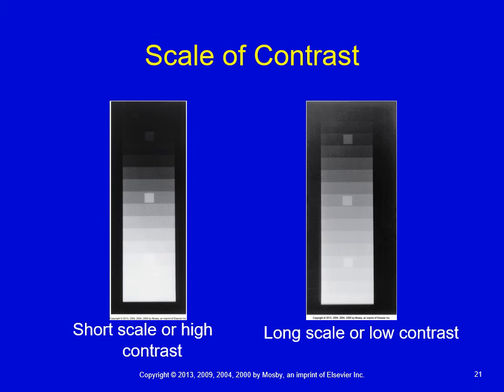So think about if you only like to wear pink clothes. If you had every color in the pink spectrum, that's what we would be thinking about here. All right, long scale contrast usually is going to be associated with high KVP. A good example of it, some books like to use the chest.